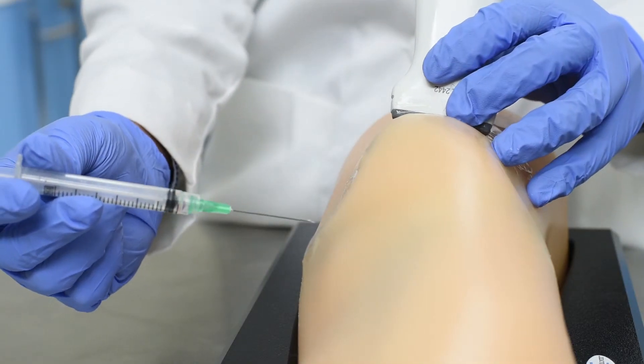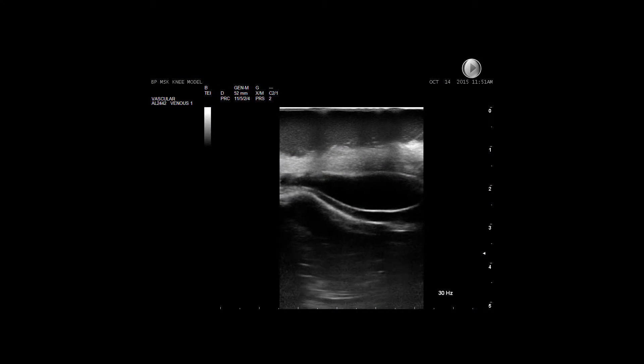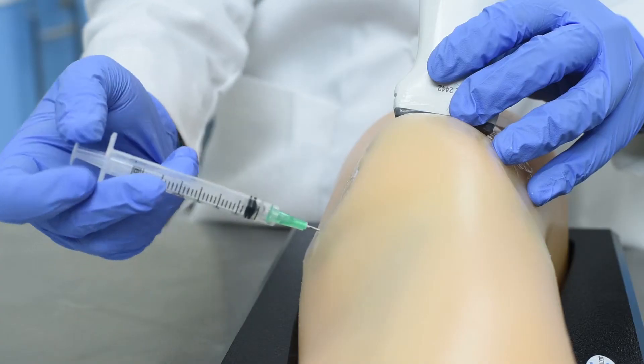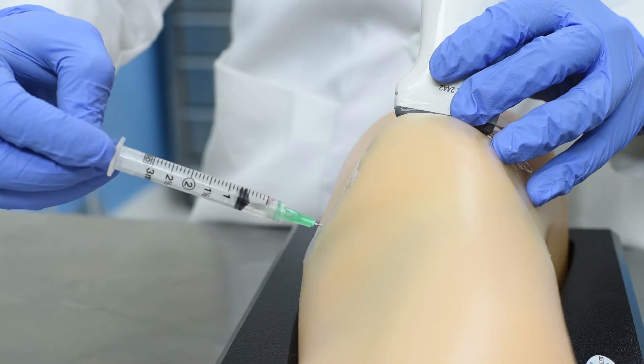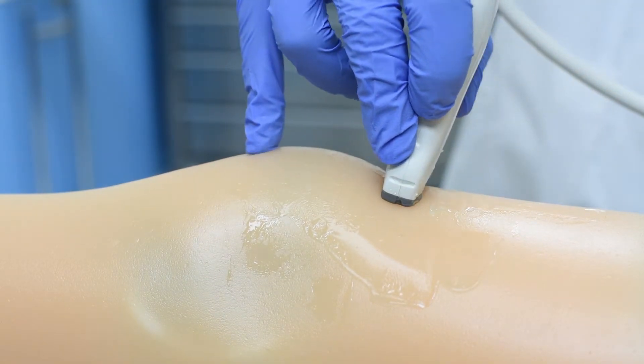With the Blue Phantom MSK knee model, gain confidence in ultrasound-guided joint injection of the knee before ever performing the procedure on a human patient. When you place an ultrasound probe on the model, you'll experience excellent ultrasound image quality.